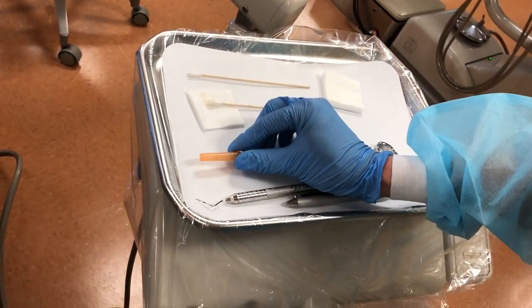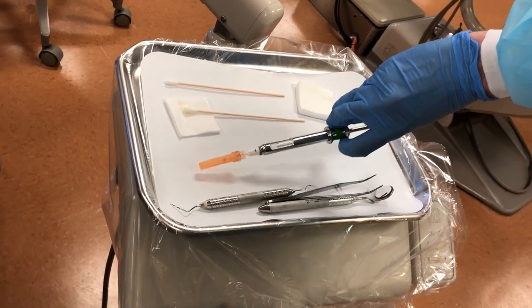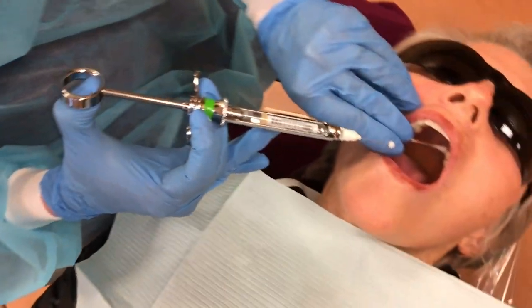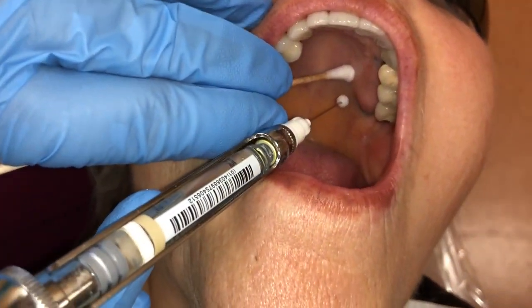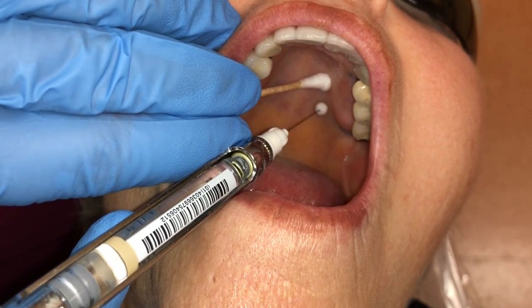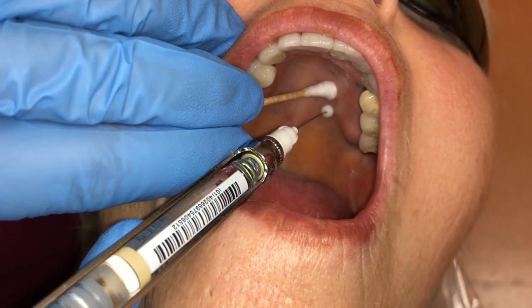It is best to avoid pressing on the soft palate. Once pressure anesthesia has been applied for one minute, uncap and achieve stability of the syringe. Slide the q-tip so that the needle can penetrate the anterior-most portion of the greater palatine depression.